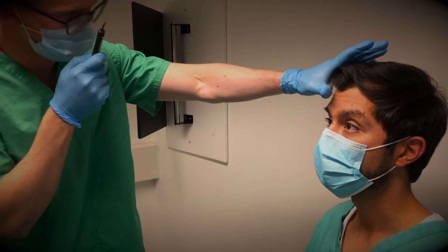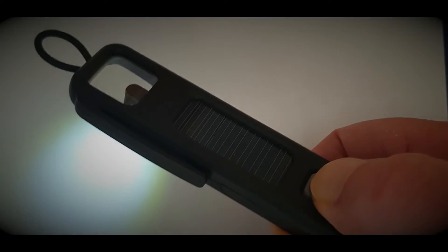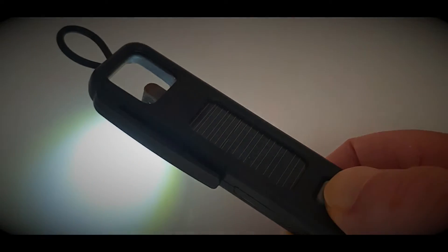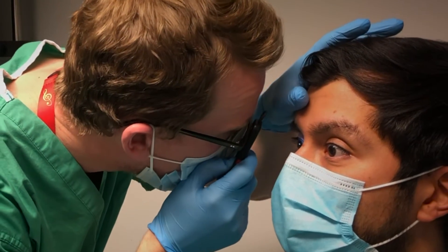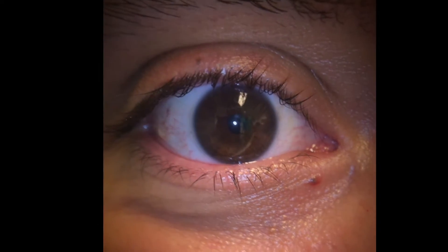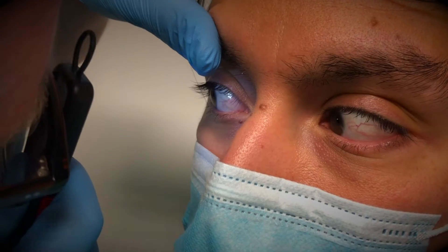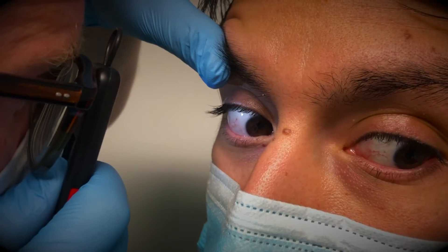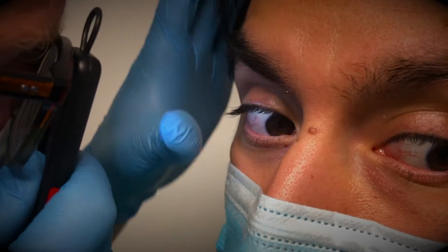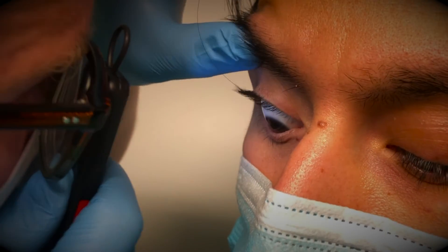Then perform a magnified examination using the arc light. Switch on the white light and hold the device close to your eye. Slowly approach the patient's right eye first until it is in focus — this will be at around 6cm. Ask the patient to move their eye outwards and inwards then up and down, while gently holding their eyelids, systematically noting the different structures seen, thinking of them in groups.